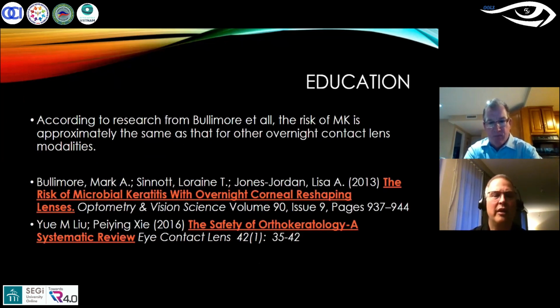Then I tell them there's a study done by Bullimore et al., and that study said, and I want you to pay attention, that the risk of microbial keratitis is approximately the same as that for any other overnight contact lens modality. You can go look up that study. It's very, very good. And then there's another one called The Safety of Orthokeratology, a systematic review, which again is absolutely worth looking at.